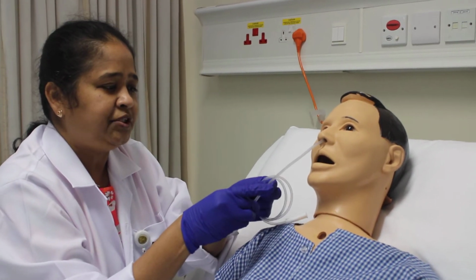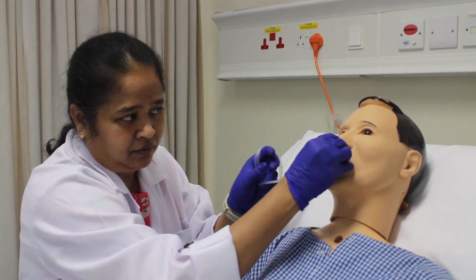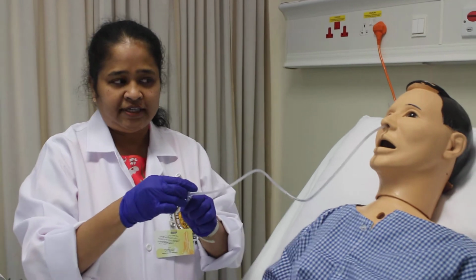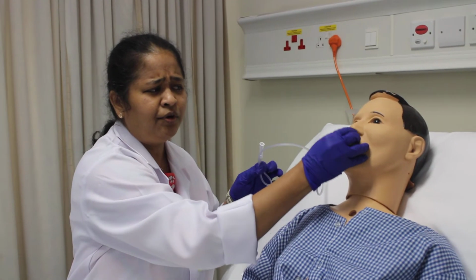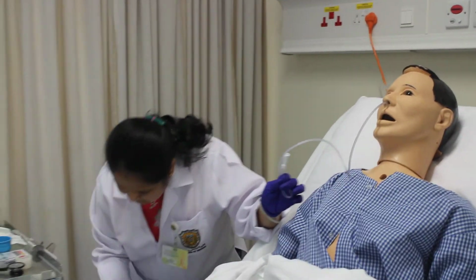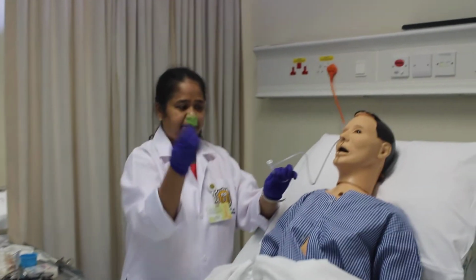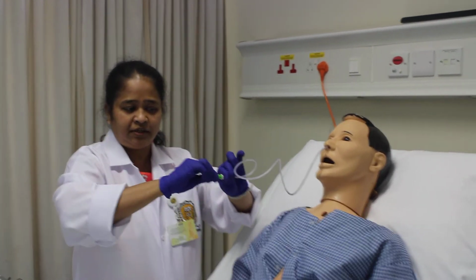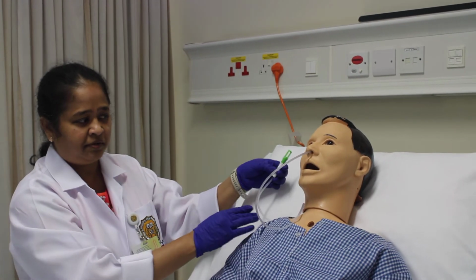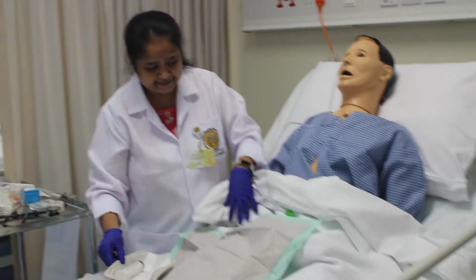Till where should I go? I should be reaching up to 50 centimeters. Now I have reached 50 centimeters. The moment you are inside, you do not want to push any air inside. So we have a cover. This is the cap. Whenever you insert the tube, immediately remember to put the cap. Otherwise, there will be a lot of air, the patient will be ingesting it, and it can cause gastric distension.